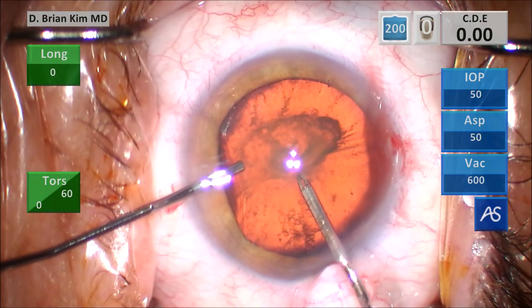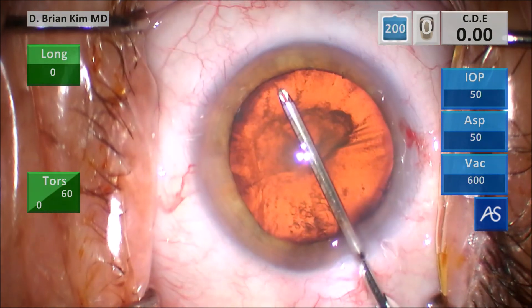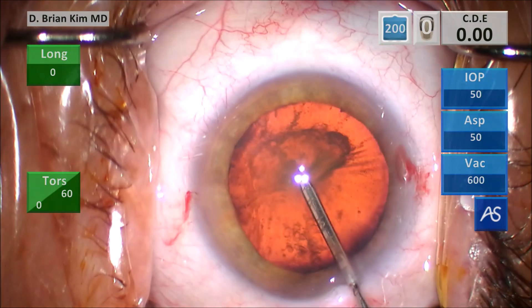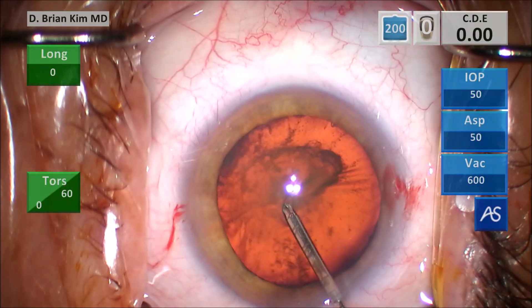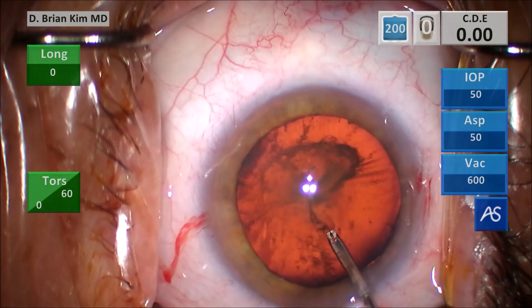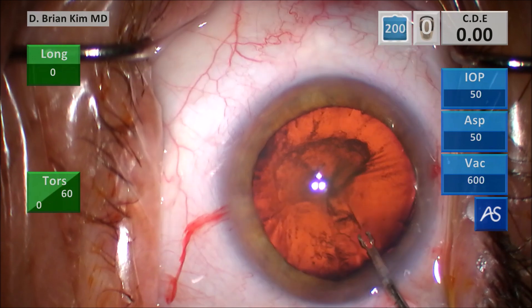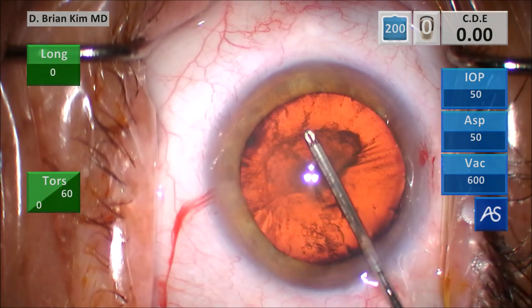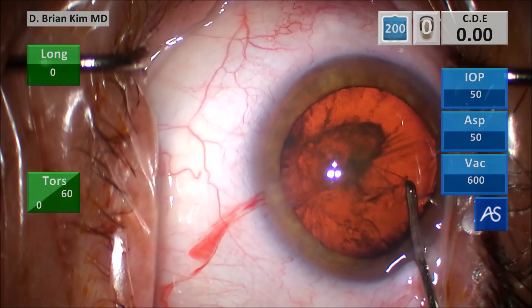I'm using my micro forceps to puncture the center of the capsule for my capsulorhexis. As I push down to puncture — these are sharp tips — you can see there are some capsule folds right there, which is an indication of zonular weakness. You shouldn't see those capsule folds with sharp tip forceps. Because the zonules are weak, pushing down causes a wrinkle or a dimple or stria within the anterior capsule, showing the zonules are not providing adequate counterforce to keep the capsule on stretch.